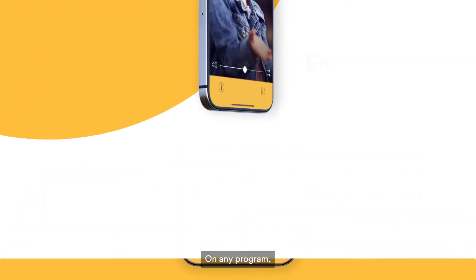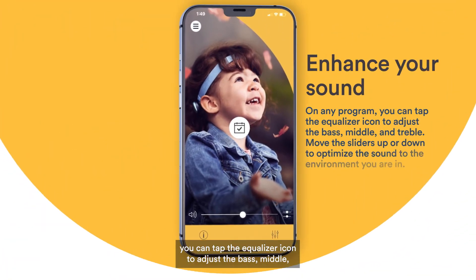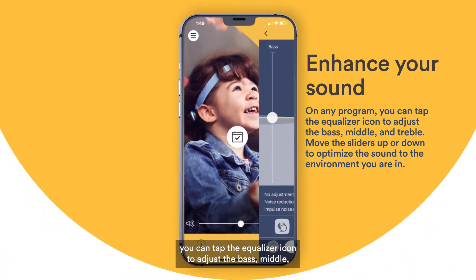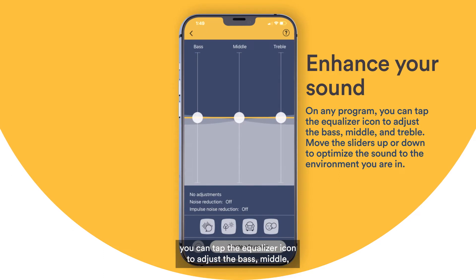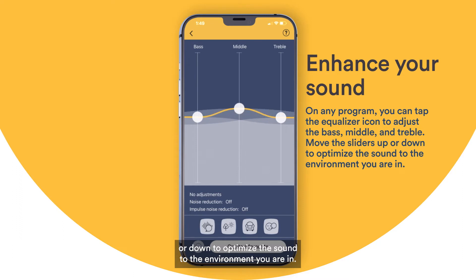On any program, you can tap the equalizer icon to adjust the bass, middle, and treble. Move the sliders up or down to optimize the sound to the environment you are in.